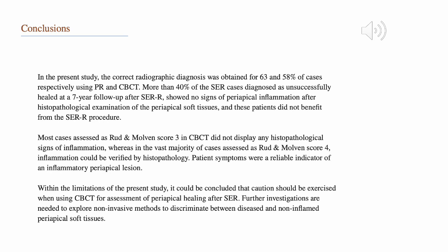Patient symptoms were a reliable indicator of an inflammatory periapical lesion. This parameter should be taken into account when dealing with the decision of performing resurgeries or observing the case further. It could be concluded that caution should be exercised when using CBCT for assessment of periapical healing after surgical endodontic retreatment.